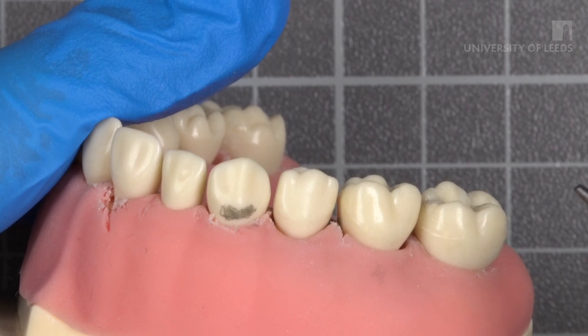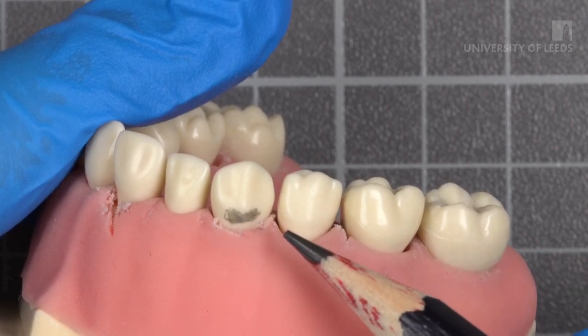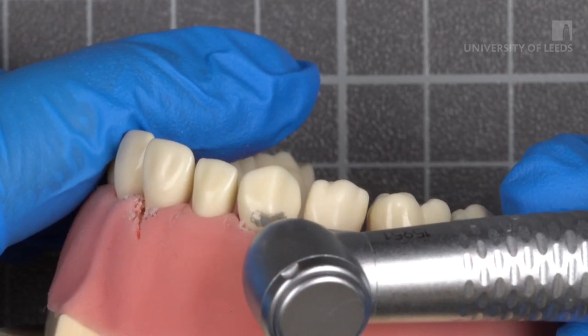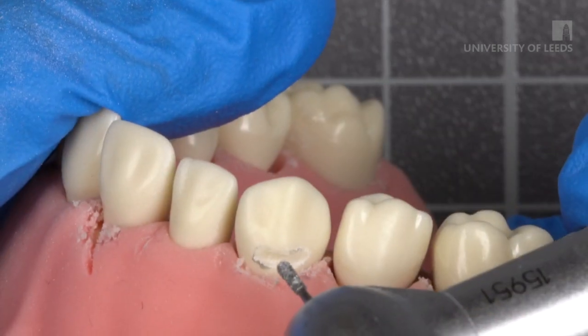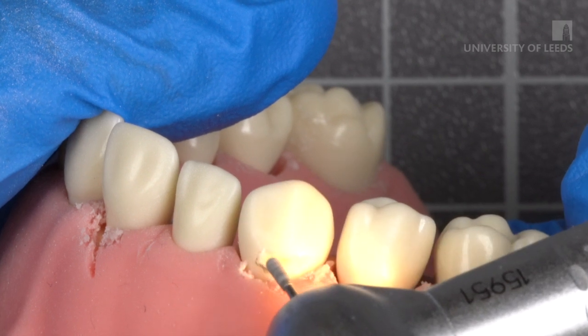Here we will work on tooth 5-3. The shaded area shows the cavity outline. With a round burr, create a crescent or semi-circle shape following the gingival contour of the tooth. Extend mesially and distally to include the caries as needed.